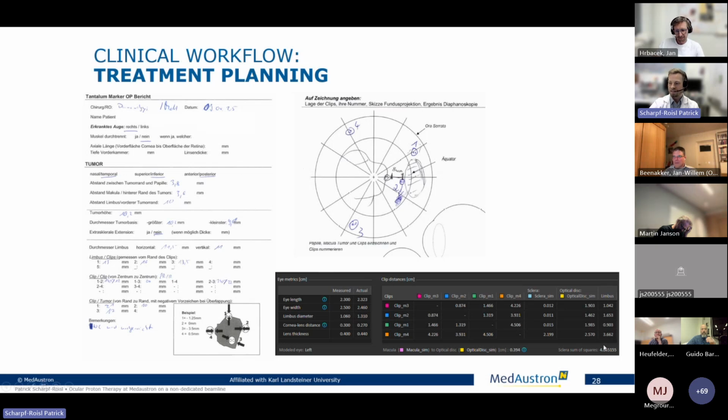And the clip rotation script that we wrote for rotating the eye, we hard coded it to 4 clips, and then we just switch to 3 clips. Sometimes then we need to make an imaginary clip somewhere. So it's a bit of.